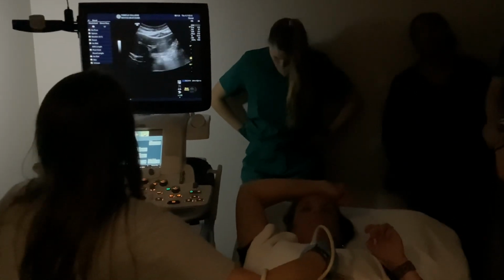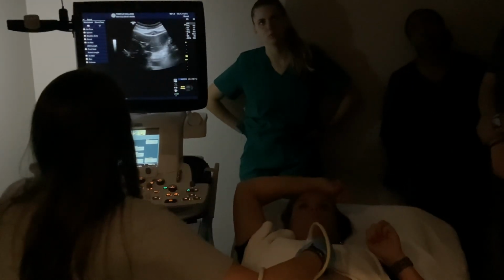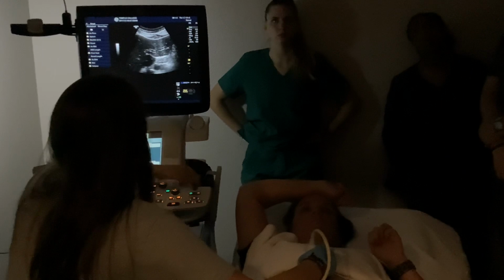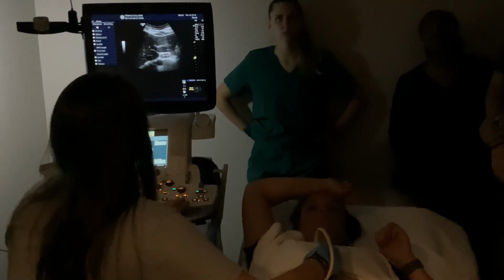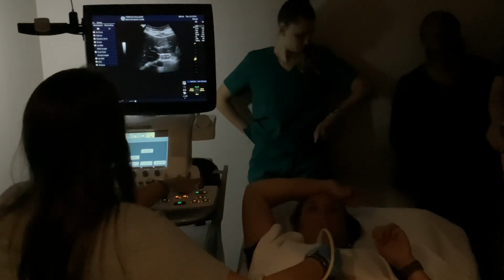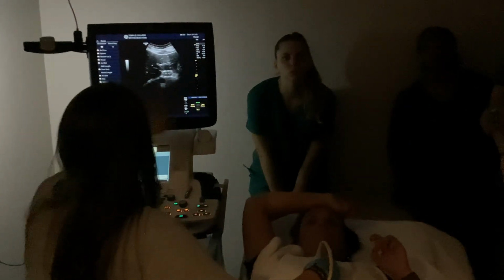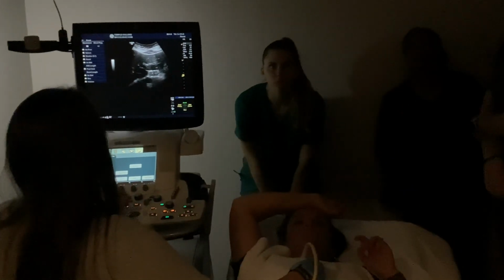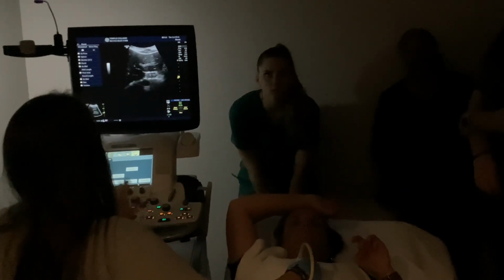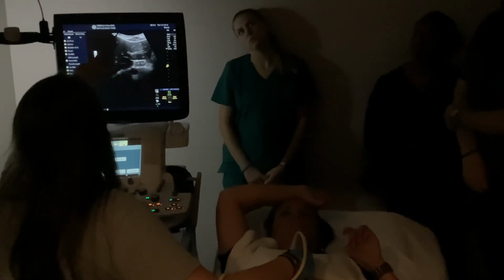So when she takes a deep breath, see here? And now I brought it nice and crisp and clear. Breathe. And I'm going to optimize my focal zones down. If I could zoom in a little bit. Do y'all see that? So this is all liver here.